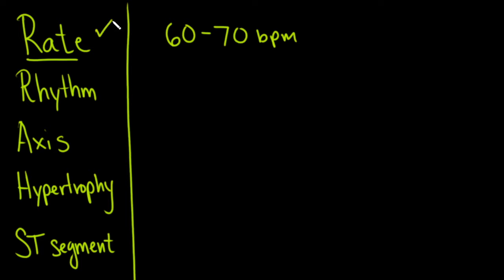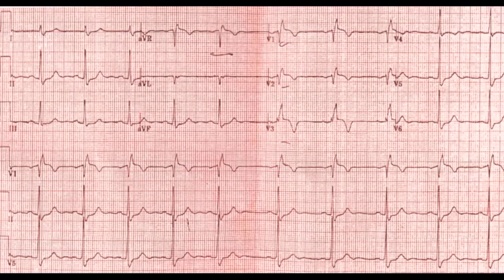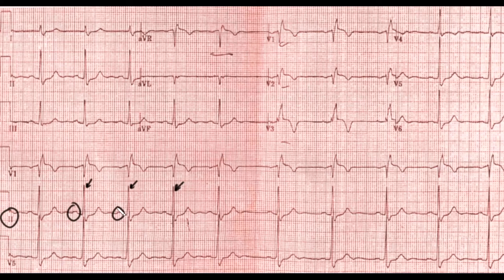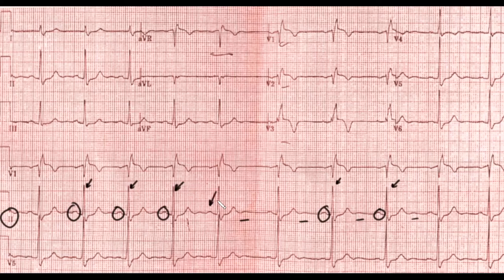Next, let's look at rhythm. The best lead for rhythm is lead II, which is the rhythm strip. We look for P waves before each QRS complex, and we can clearly see P waves before each one. There's a small extra deflection that is probably a U wave, sometimes associated with low potassium. We call this sinus rhythm.